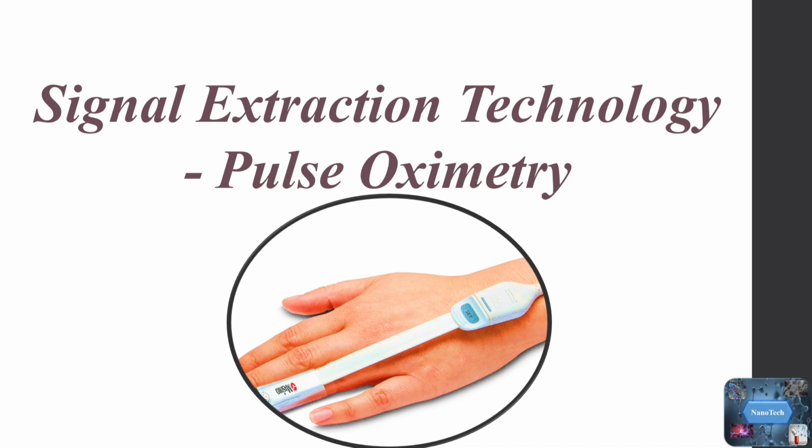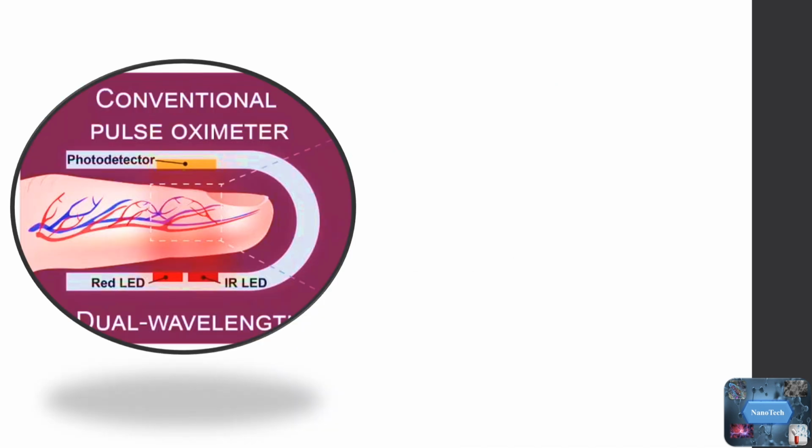Conventional pulse oximetry determines arterial oxygen saturation and pulse rate by using a theoretical model which was developed over 25 years ago. This model assumes that arterial blood is the only light-absorbing pulsatile component in the optical path. The ratio of pulsatile transmitted red to infrared light, the optical density ratio, is used to calculate SpO2 through the use of a calibration equation generated by human in vivo calibration studies. Limitations of conventional pulse oximetry.